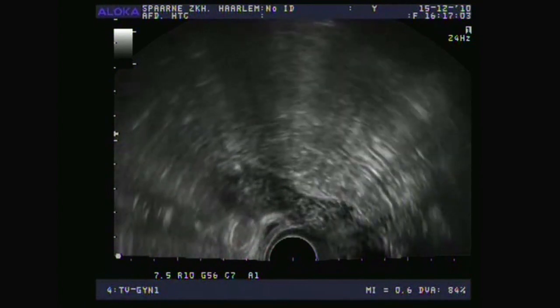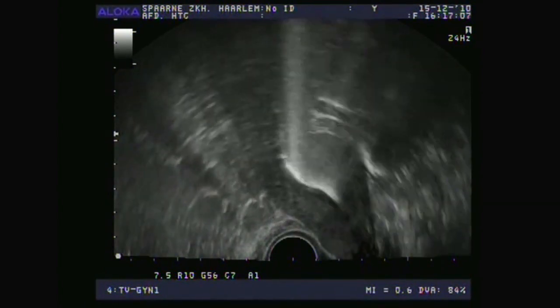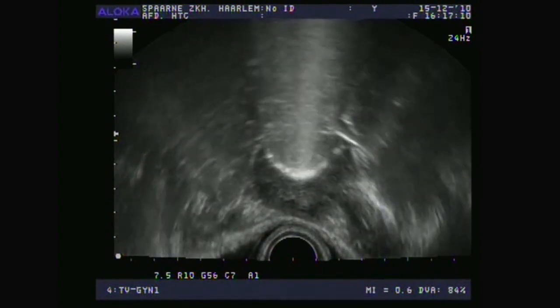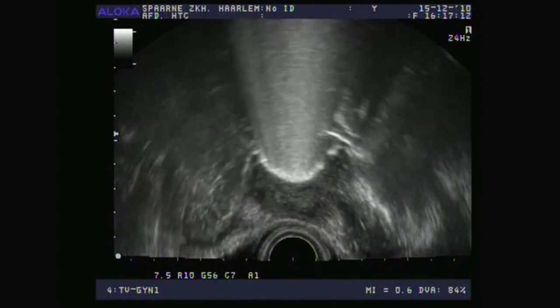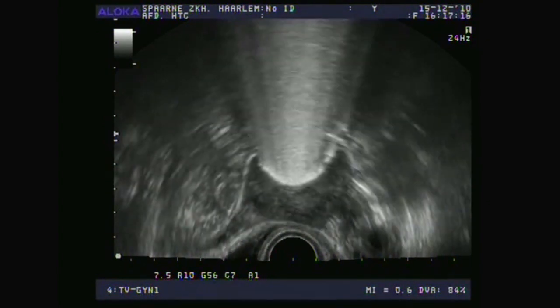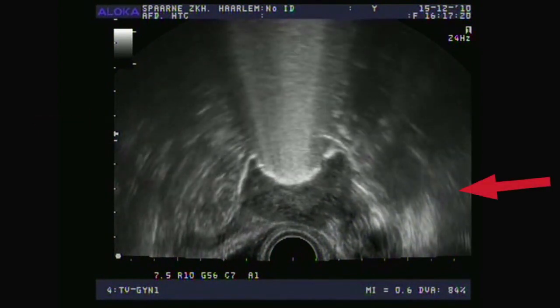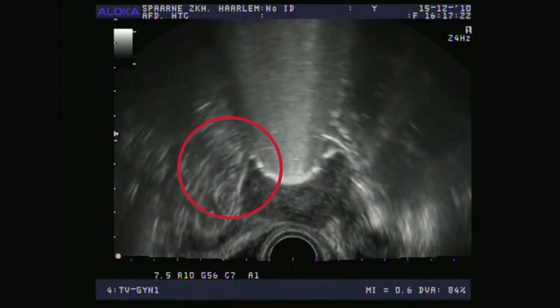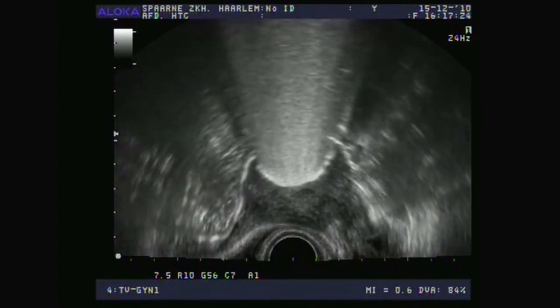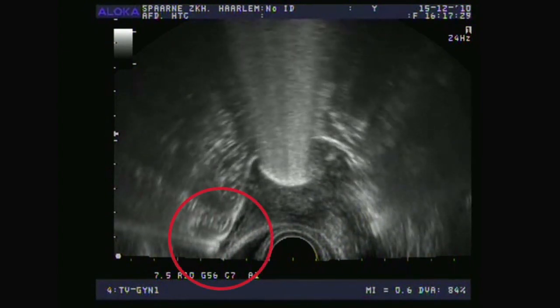Now I'll turn it a little bit to the left and to the right, and now I'll turn the probe about 90 degrees from a longitudinal cross-section to a transversal cross-section. This is the transversal cross-section, and you can see that this is the right and this is the left — the right fallopian tube is filled immediately. Then we focus on this right fallopian tube, where you will see the foam appear in a moment. It will really overflow into the abdominal cavity.